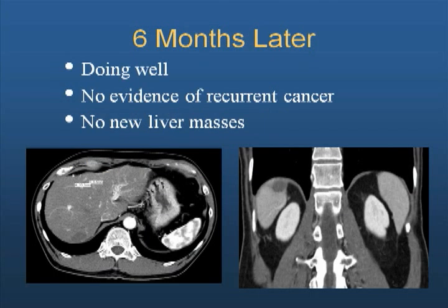6 months after discharge, the patient is doing clinically well. Per our protocol for monitoring patients with hepatomas following resection or ablation, he underwent surveillance CT or MRI every 3 months. 6 months after ablation, he now shows no evidence of disease recurrence and only a hypodense microwave scar.